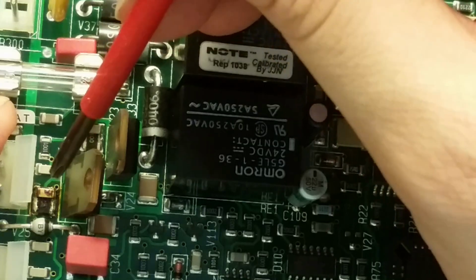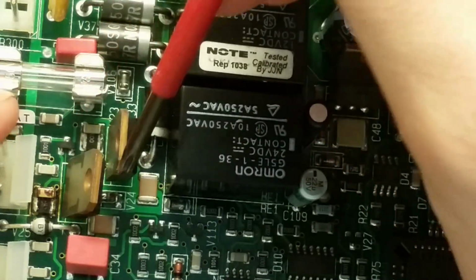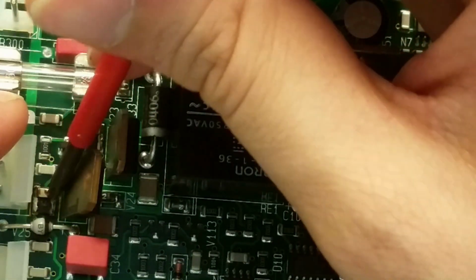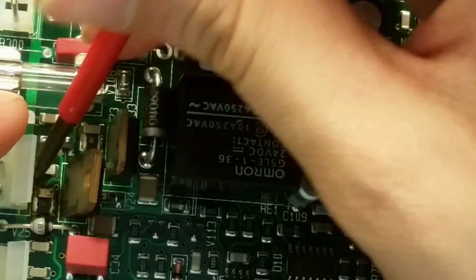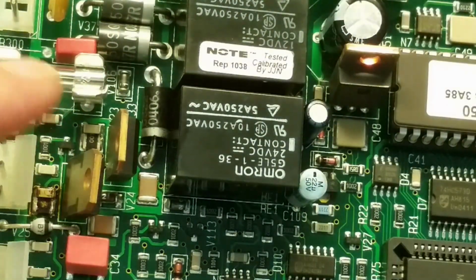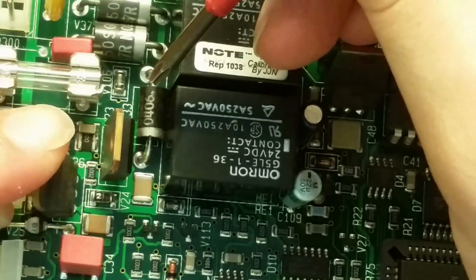Same thing on the back here. But a pretty dodgy soldering there. That looks very bad. Have they maybe done that afterwards? That doesn't look good. Looks very bad. This one here looks much better.